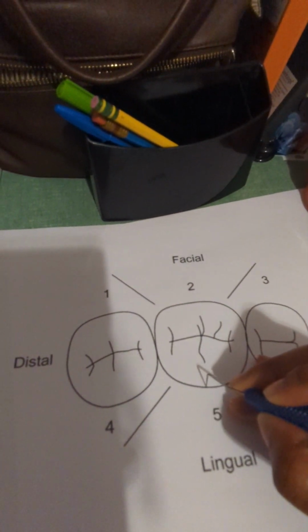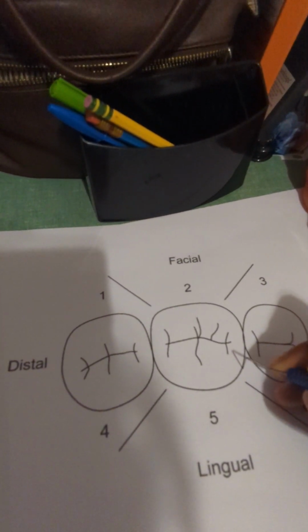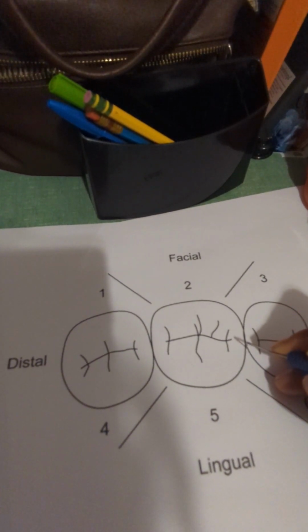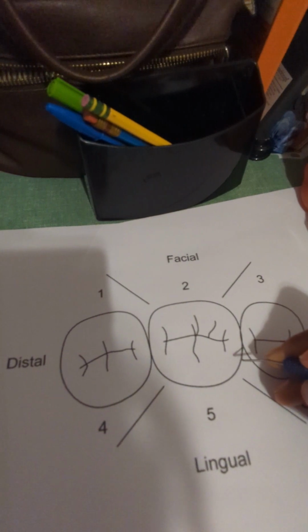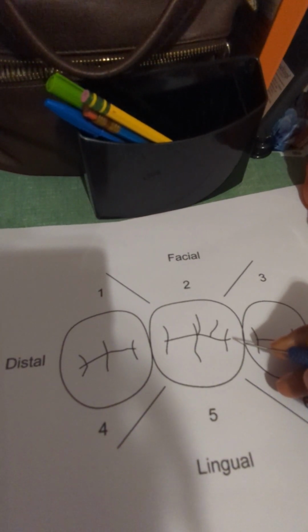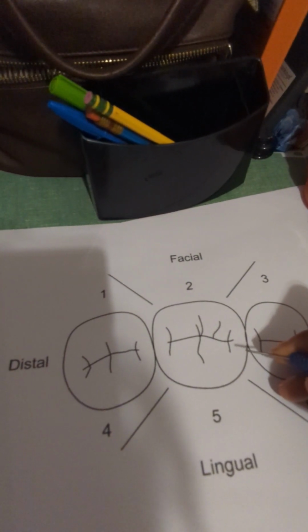And now you will go mesially. As you're doing so, make sure to note your depths. And then you will go mesially as well into the interproximal space. Again, you're not tilting too much, you're doing a slight tilt interproximally.